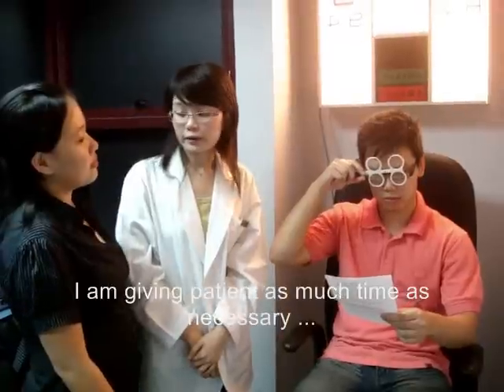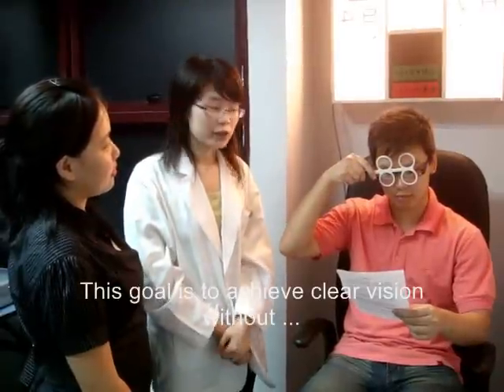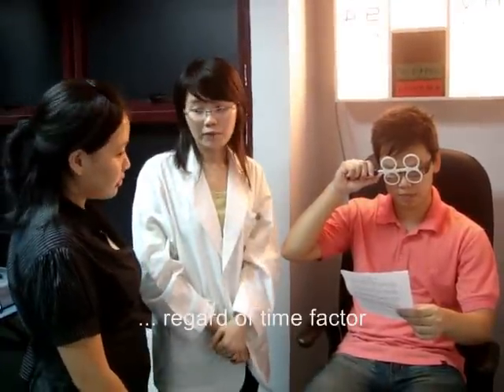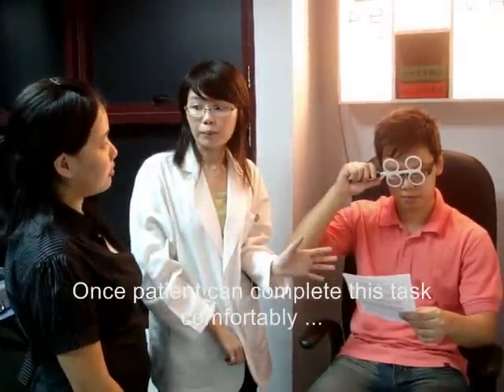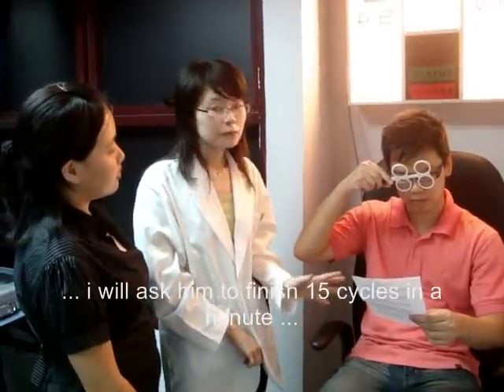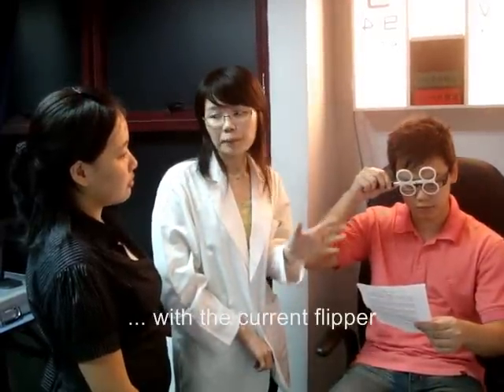Now I am giving the patient as much time as necessary to clear and read the print. The goal is to achieve clear vision without regard to the time. Once the patient can complete this task comfortably, I will ask him to do it in 15 cycles within a minute with the current flippers.